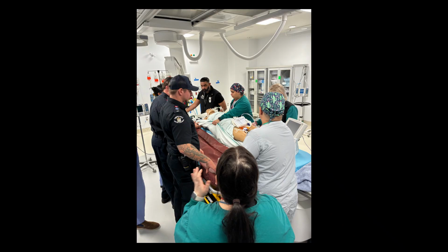When EHS arrives, the patient will be slid over to the stretcher. EHS will bring stretcher number 9, which fits the pack rack. Prior to moving, this is the optimal time for the RN to lead a pre-transport timeout to optimize patient safety.